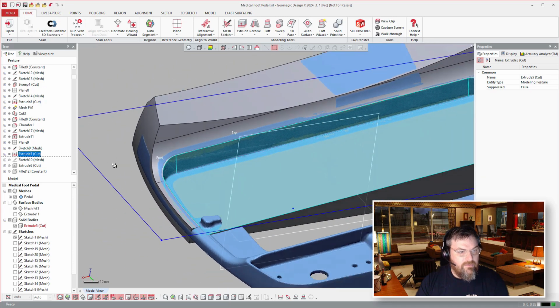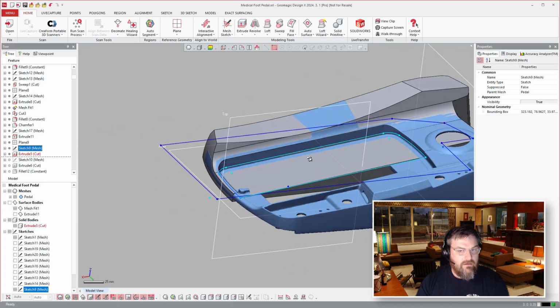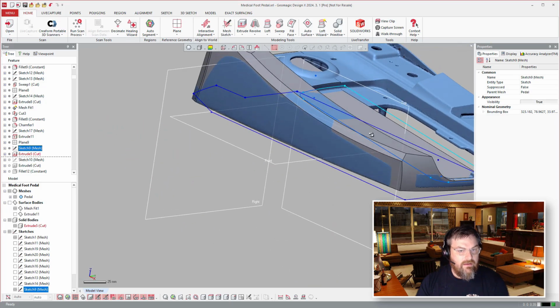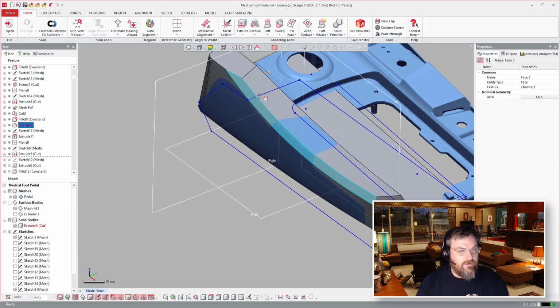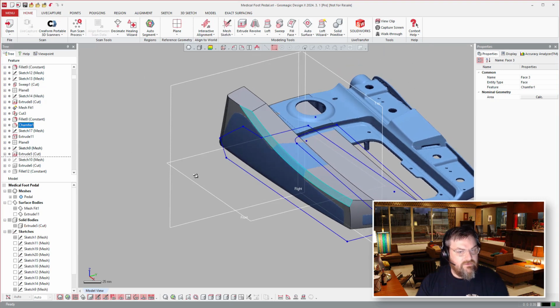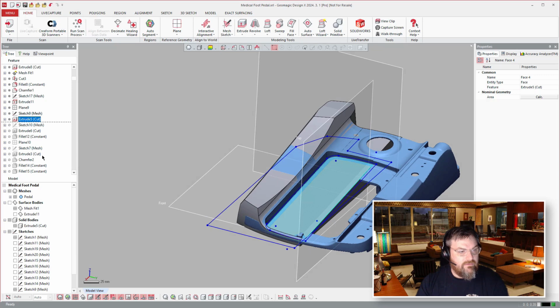And we'll just zoom in here. So this profile sketch right here, cutting away. And in this chamfer, you see here, if I click on the surface to find the last feature that worked with that feature there, so that's a chamfer right here, and then that. So just cut forward a few more.